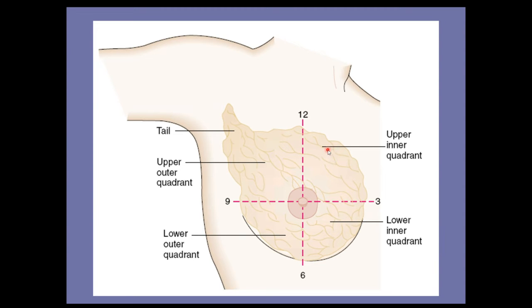But this is clinically, and all of you know that ultrasound is also done. We are with the patient and we can see the exact location. In X-ray we only see an image; we don't have a patient with us. So on ultrasound or clinically we can define further.